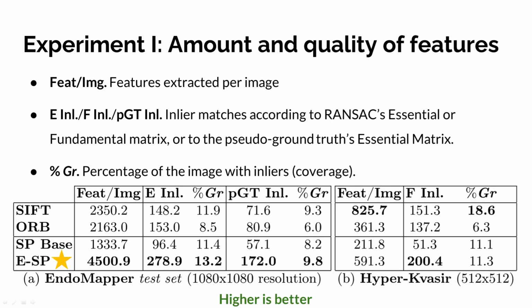In these metrics, our model performed better than the others, especially in the EndoMapper test set. The HyperKvasir test set is very different from the one used to train the network. The model performs well, but the improvement is not as significant.